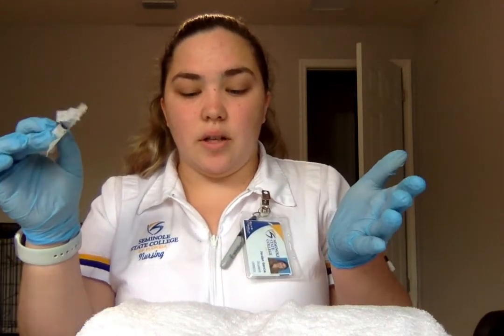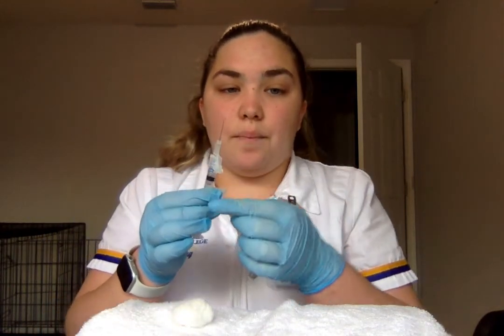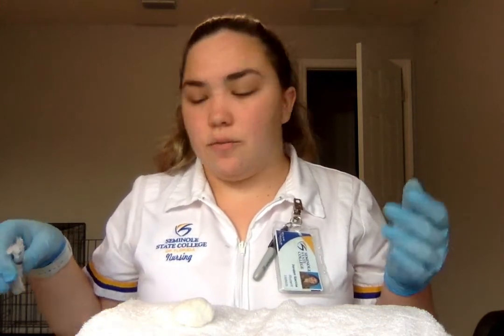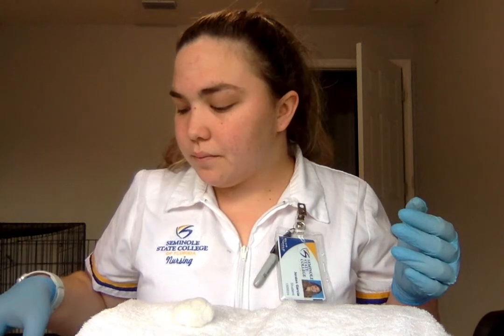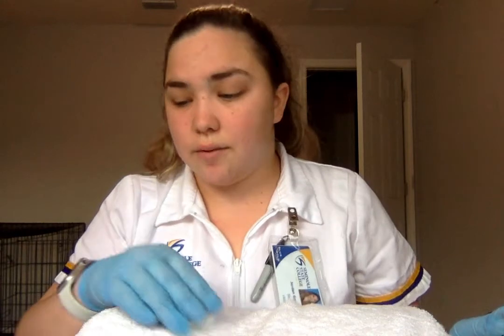I'm going to let my hand go, the muscle go, and then I'm going to cover it with a gauze pad and have the patient hold. And then while the patient is holding, I'm going to engage the safety device. I would normally engage the safety device, but because I have to reuse these needles, I'm going to do the 1 scoop method to recap it. So I did the 1 scoop method. And then once I have engaged the safety device, I'm going to put it in the sharps container. So now that that one is done, I'm going to go ahead and move on to her subcutaneous injection.